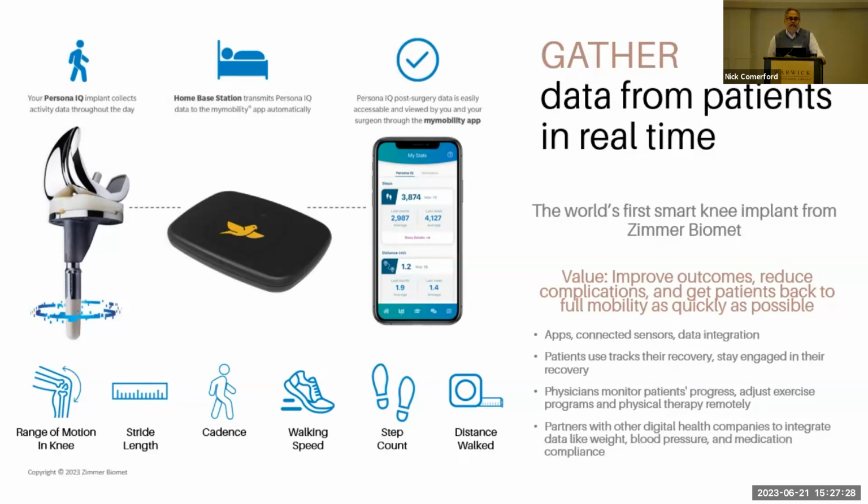So your knee implant now can transmit data to a router that's in your home, and then it transmits that data both to a doctor's portal and to an app for the patient.